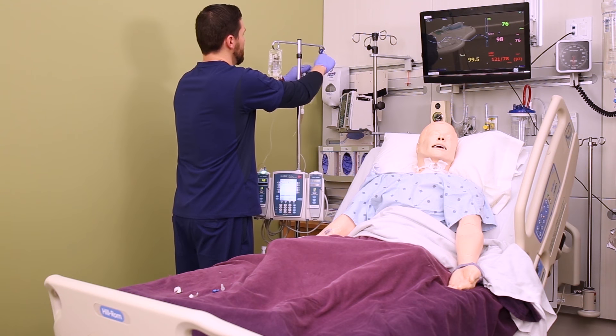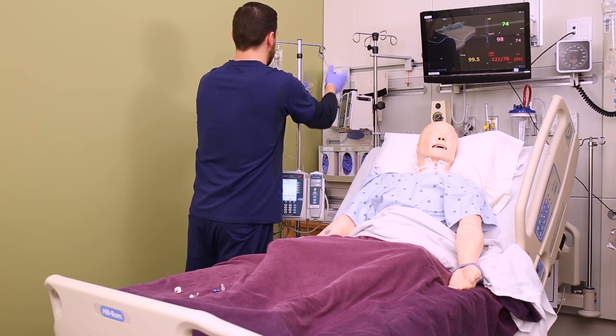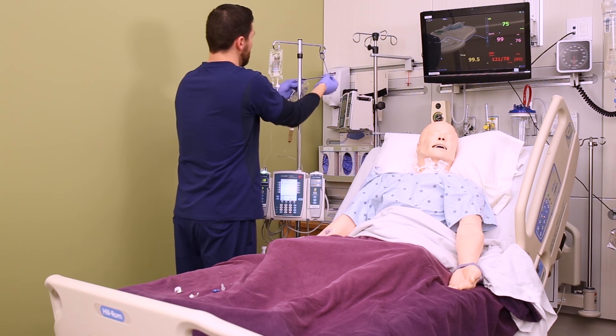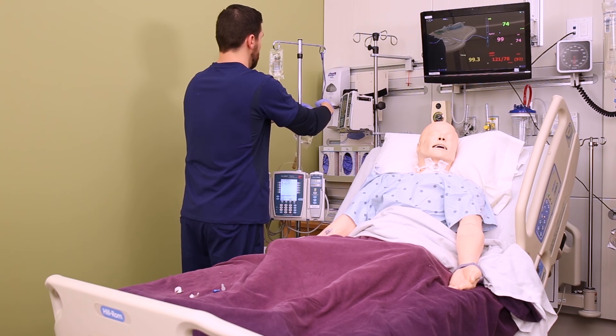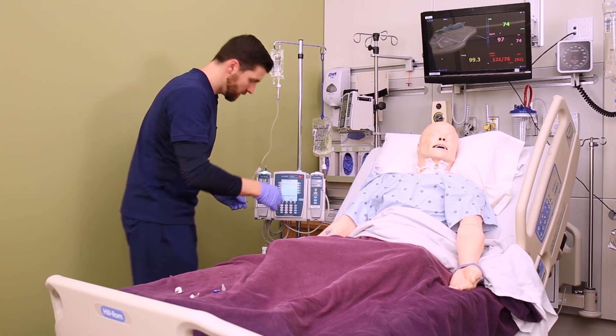There's a hook in the secondary tubing package. You're going to get out that hook and use it to lower the primary bag to below the level of the secondary bag. This is how the pump knows which bag to pull from — it pulls from the higher bag.